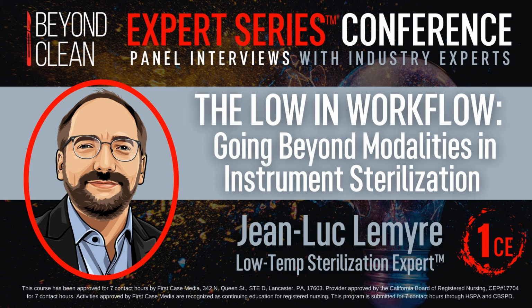Right. But with peroxide, it's very important to make sure that everything that goes in there respects the claims of the sterilizer, and also that the monitoring is done correctly with CI, BI, and PCD to ensure that any problem would be caught.